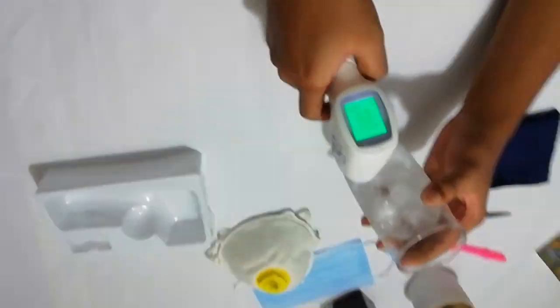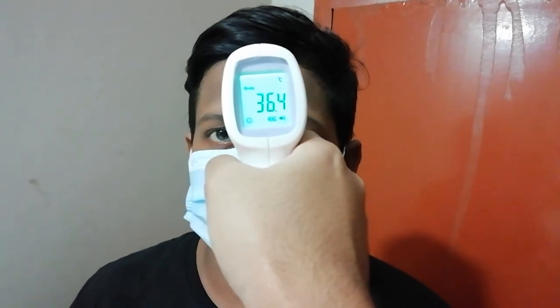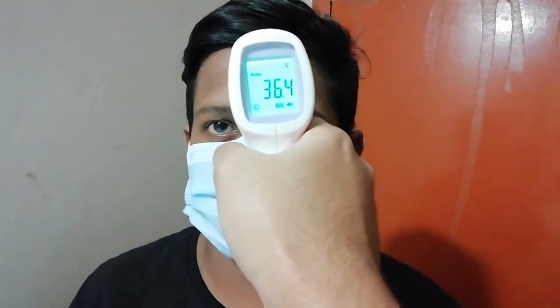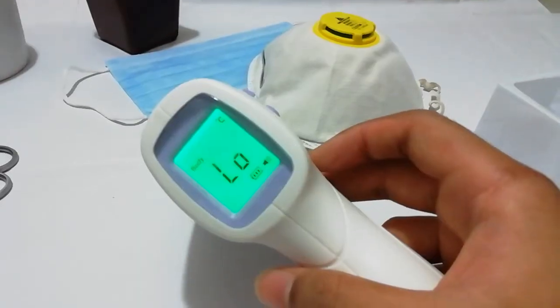And here, I have another option. And it's ice water. Let's see its temperature. You guys can see it's so, so, so low, below body temperature. So, it's not coming inside. But I can guess it could be above 0 degrees Celsius or 0.3 or something.